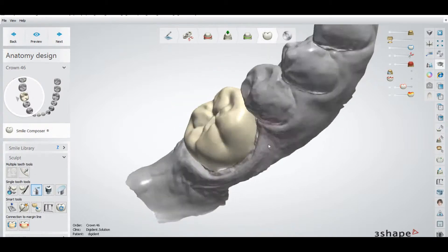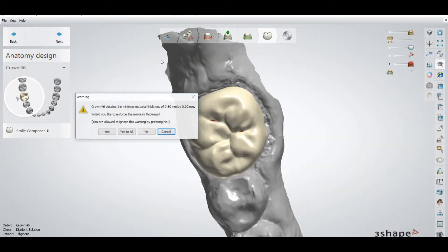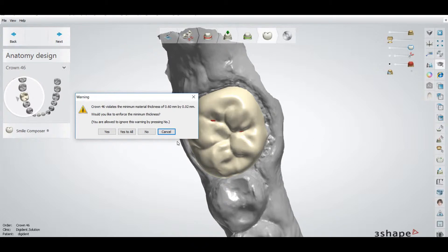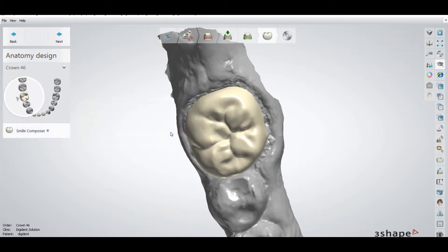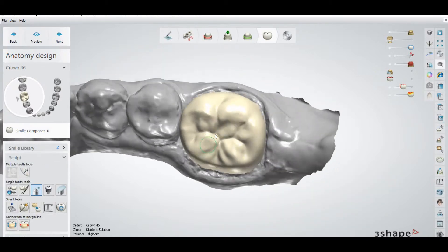After designing a restoration, when you go towards the final step, a warning pops up that you are violating the minimum thickness and asks if you want to enforce the minimum thickness. If you press No, it will proceed and the thickness will remain the same. But if you press Cancel, it will go back to the dental designer.